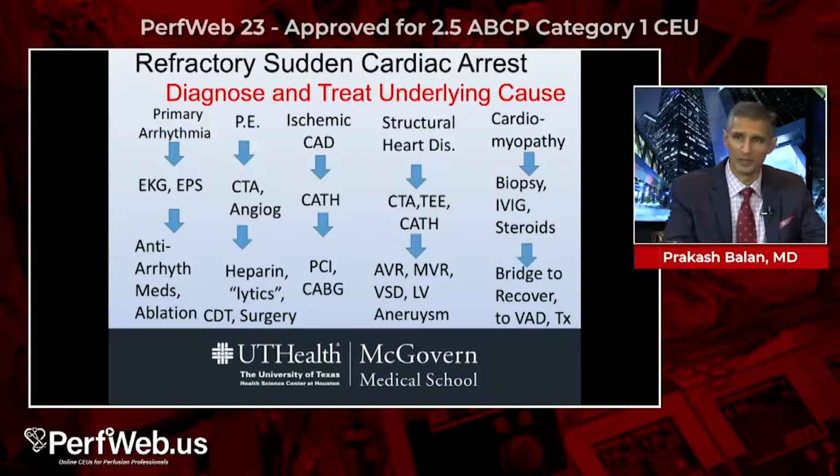You can use antiarrhythmic medications, but if you can't bail them out with your lidocaine drips and amio drips, you really need to go to hemodynamic support because you're going to lose the rest of the body while you're trying to control the arrhythmia. Massive PE, as I mentioned, is another situation that can cause complete hemodynamic collapse. The use of ECMO under those circumstances allows you to quickly and rapidly support the patient while you choose a treatment strategy. And as we know now, the number of treatment strategies are exploding. Catheter-directed therapies, surgical embolectomy are all possibilities here.